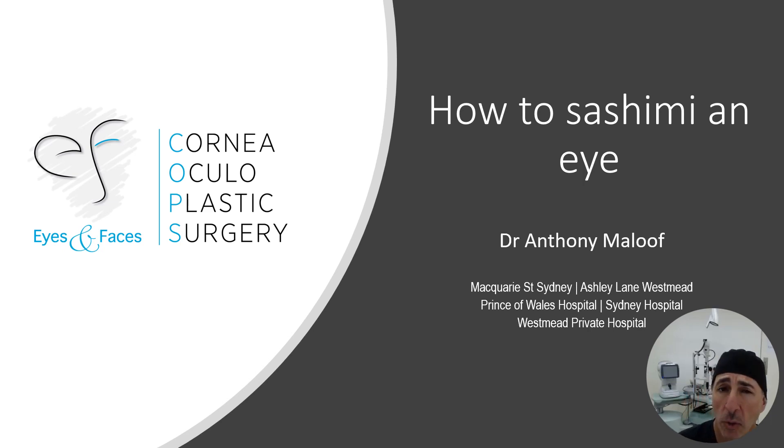I'm Dr. Anthony Maloof, a Cornea and Oculoplastic Surgeon in Sydney. Welcome to this video on how to sashimi an eye — or more correctly, how to sashimi a cornea. We're doing this because it's how you prepare a cornea for a layered transplant. I'm peeling off the front of the eye to replace the front of the cornea, which is called a stromal transplant — I'm replacing the stroma. But technically, yes, I am performing sashimi on an eye.